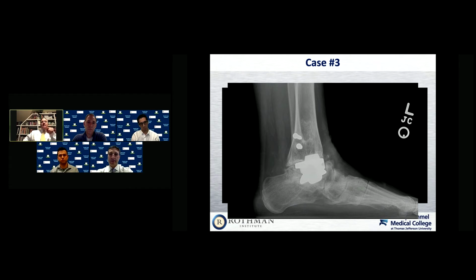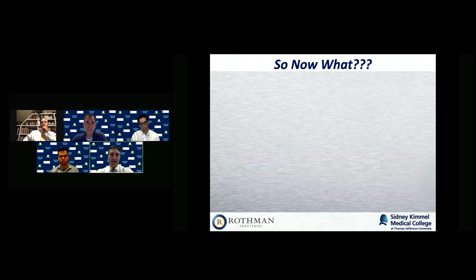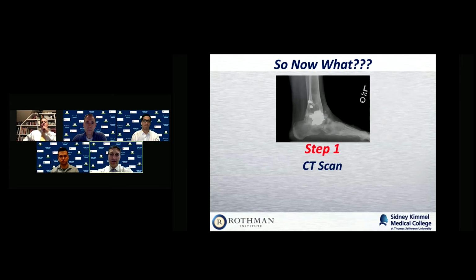Next. What's all that cystic change we're seeing there, Brian? Where are you talking about, in the distal tibia? No, it looks like it's at the navicular, maybe the cuboid. You just have these kind of lytic punched out areas. I think that's probably projectional on my side. I don't see that, but to answer that question, it's necessary to get a CT scan to look into that. That's obviously our first step here.